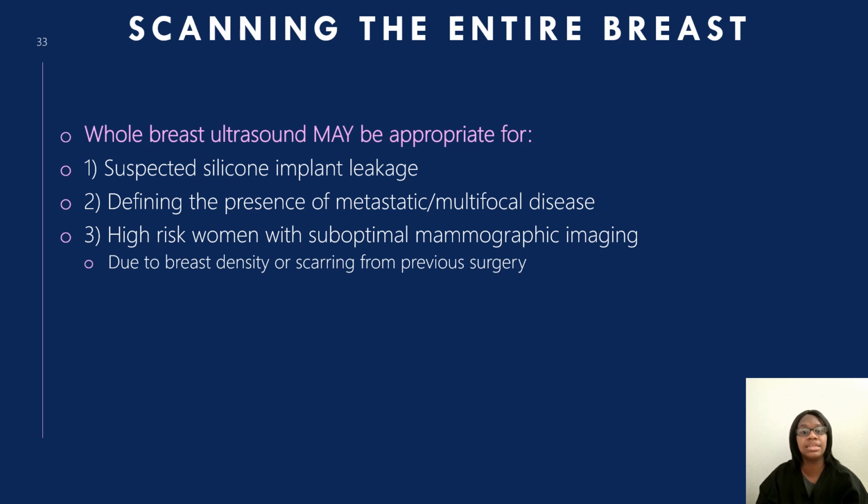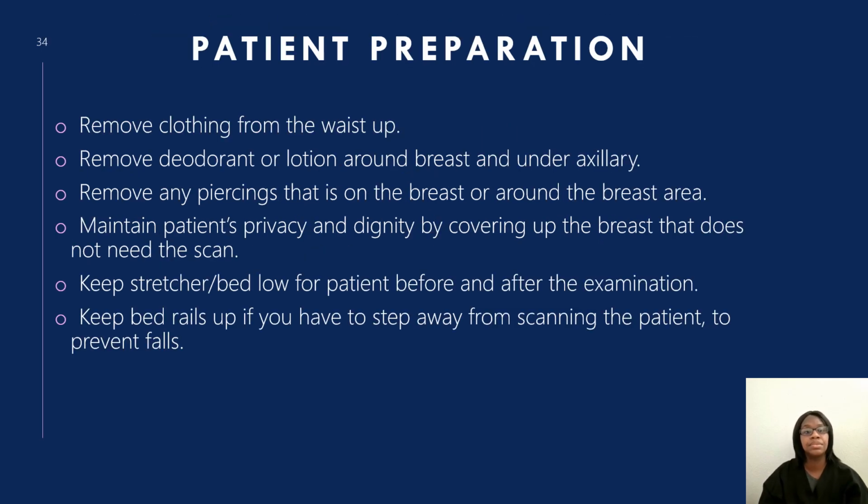When you're scanning the entire breast, sometimes we call it a complete breast ultrasound. This can be for suspected silicone implant leakage, high-risk patients due to breast density or scarring from previous surgery. Sometimes I've seen patients come in for a screening mammogram and maybe they're high risk or they have a personal history of breast cancer, so they come in for a complete bilateral ultrasound.